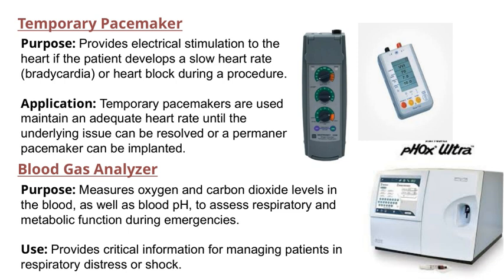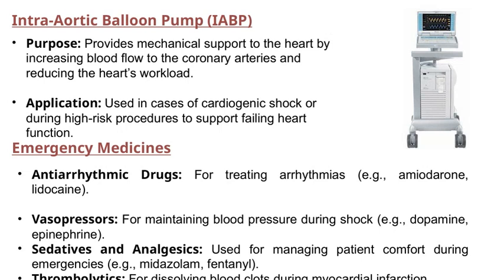Both of these tools, temporary pacemakers and blood gas analyzers, highlight how vital real-time monitoring and intervention are in critical care. Let's talk about the intra-aortic balloon pump, or IABP.